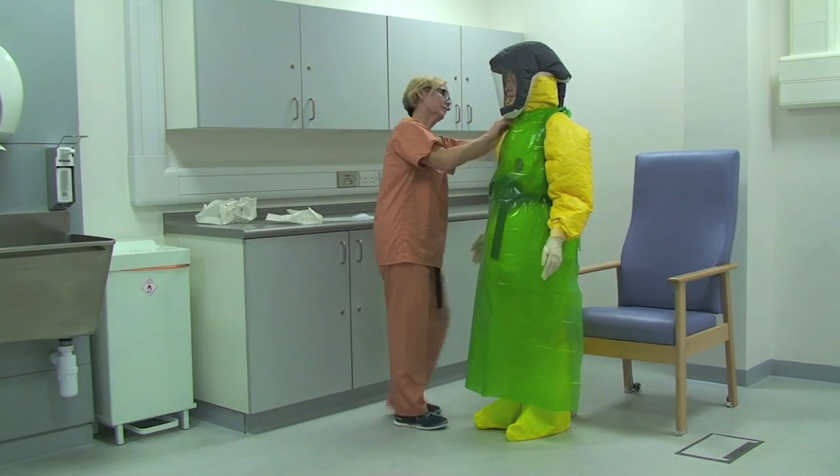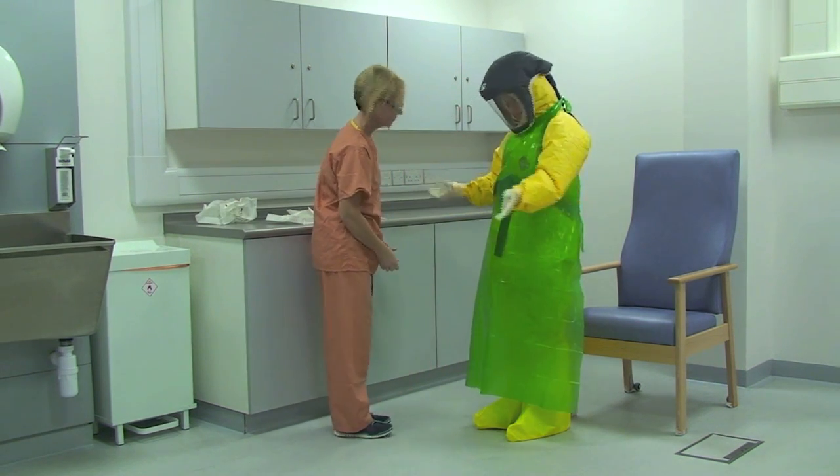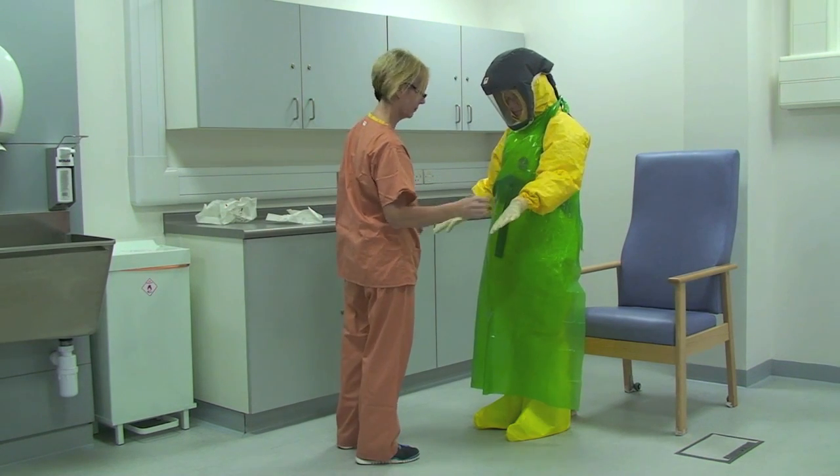The buddy then checks the healthcare worker to ensure the integrity of the PPE before the healthcare worker is cleared to enter the isolation room.